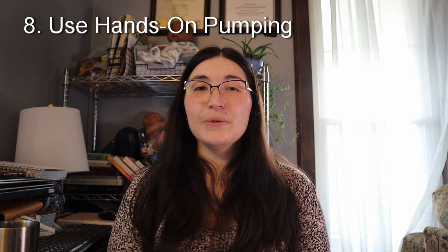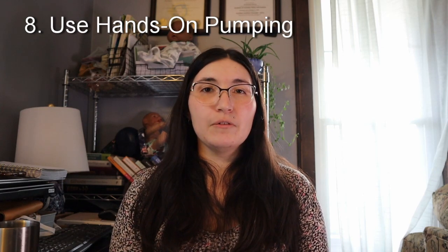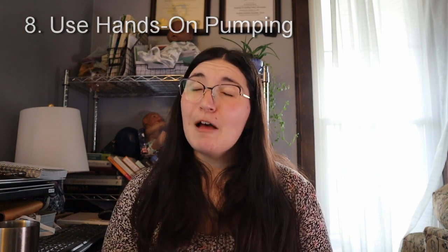Number 8, use hands-on pumping. If you are having trouble getting enough milk to express, and that's really common because pumps don't remove milk as efficiently as babies do. If you're exclusively pumping, then you're a pro. You know what you're doing here.